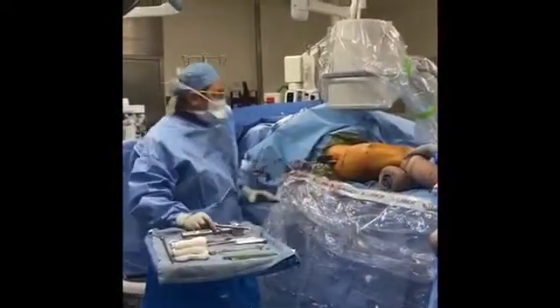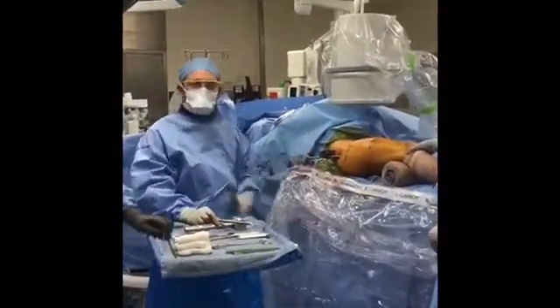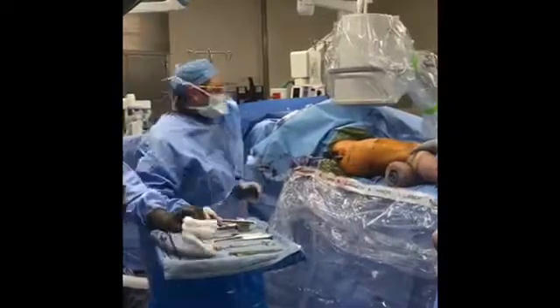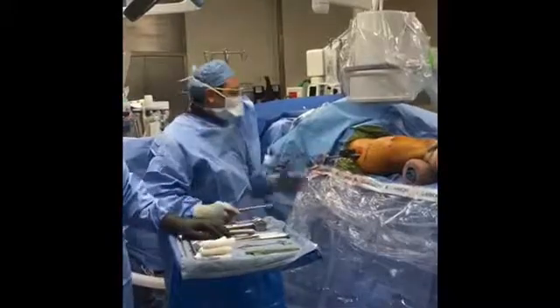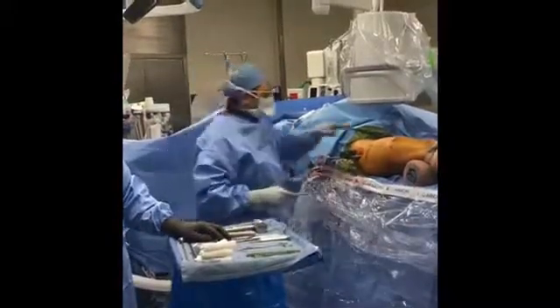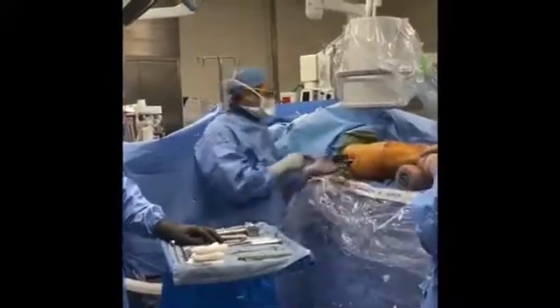The nail is in now, and across the osteotomy site — we've already completed the osteotomy and the nail is across the osteotomy site. So now we're just gonna stabilize the nail with two screws above and two screws distally.